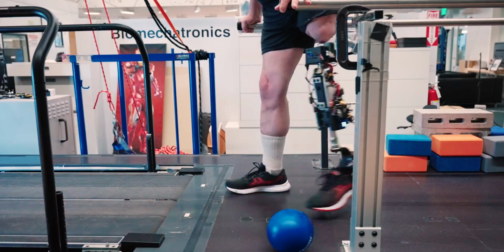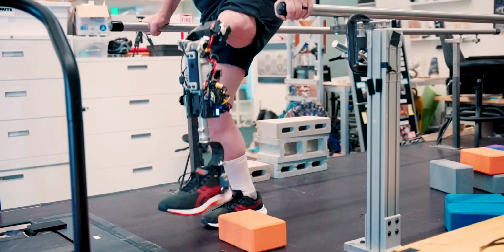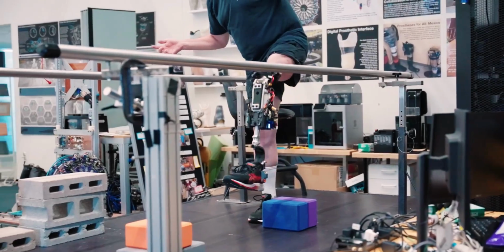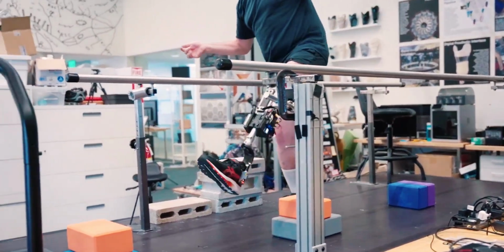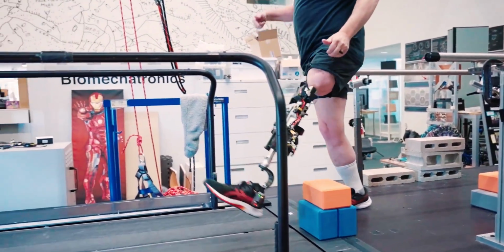Researchers at MIT have developed a method to restore astoundingly natural movement in people who have had leg amputations above the knee. Rather than fit an artificial limb into a socket, the team has created a bionic knee that can be integrated with a patient's muscle and bone, enabling them to move much more easily than with previous prostheses.